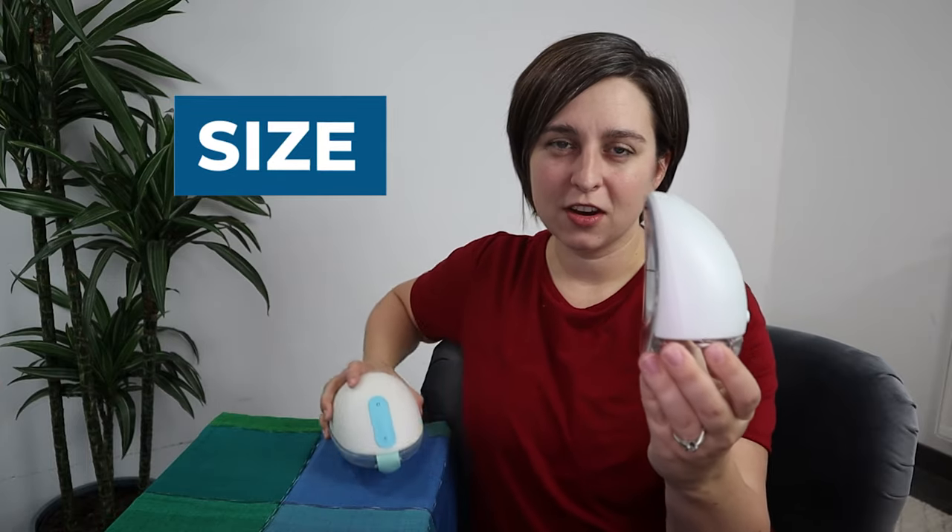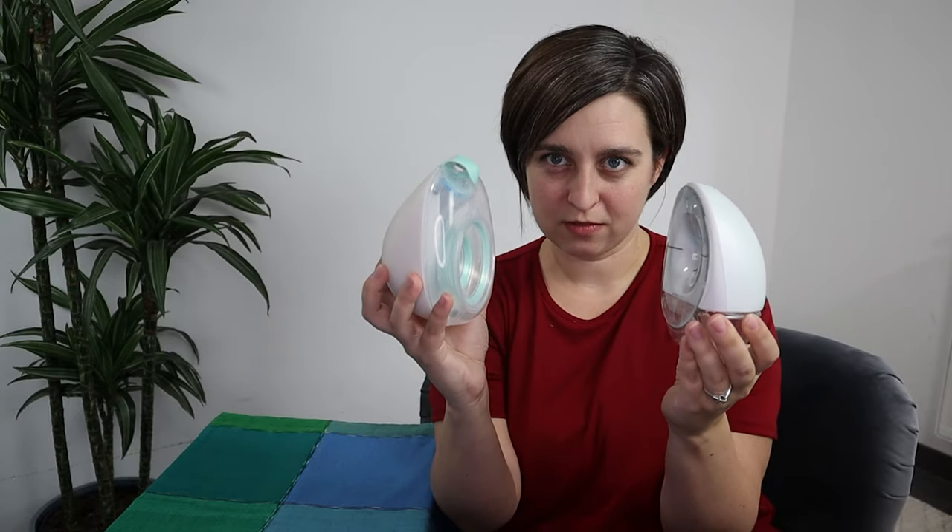Next category is size. The Elvie is a little bit smaller and sleeker than the Willow. I'll put them both on so you can see them in real life — I've got the Willow on this side and the Elvie on this side. The Willow is a titch bigger. Both have a nice shape, but the point on size goes to Elvie.